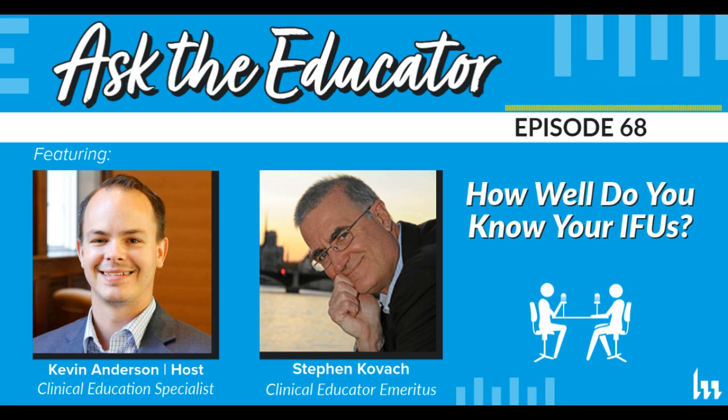And so this is going to be the curveball I'm going to throw you right now, Kevin. All right. I have an IFU from a manufacturer that makes surgical instruments. These instruments have been being sold for 50 or 60 years by the same company. For their suction, it says, wash in warm water, use the appropriate brush, dry, steam sterilize according to your policy. That's it. That's all it says.